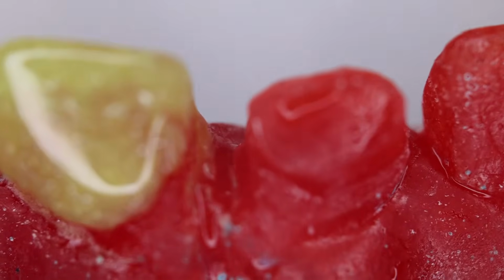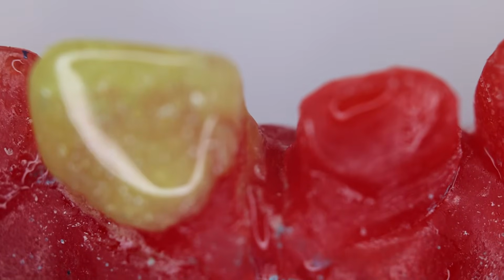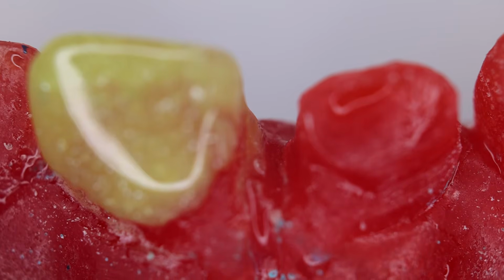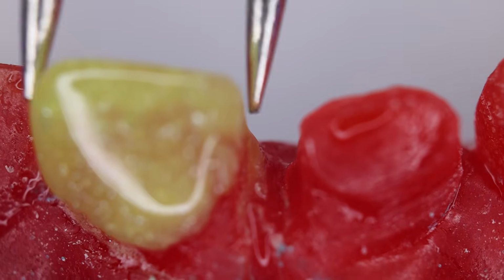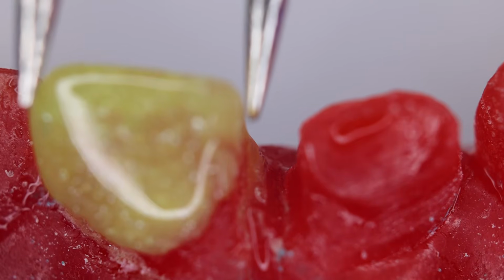First, when the tooth we have planned is to be done with this strip crown, step 1 begins with the selection of the crown. For that we need to select the crown on the basis of the mesodistal width. Over here we have the mesodistal width of this adjacent tooth, so we will look at it.